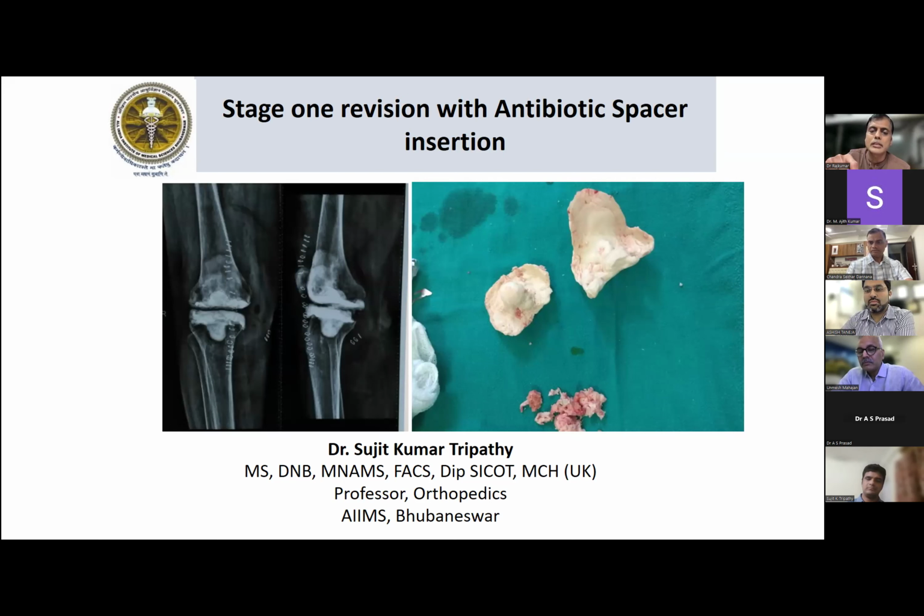And then the advantage is that we can cement the stem through the cones. So the bony integration also is very good with those cones. So in those cases, we can use cones, particularly in the femur. Okay. Thank you.